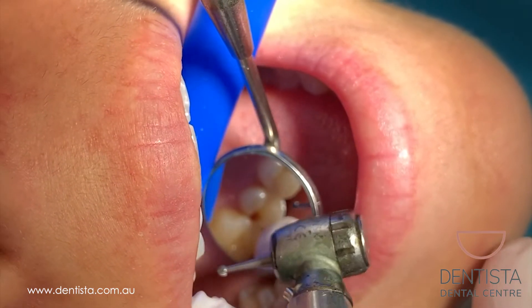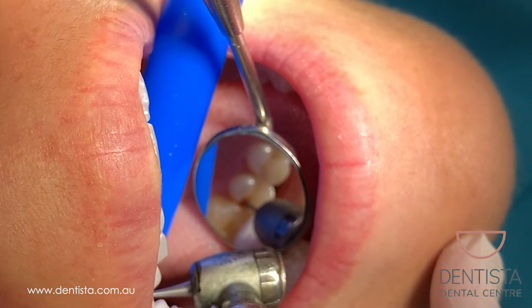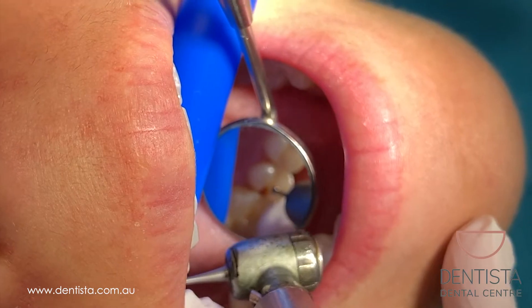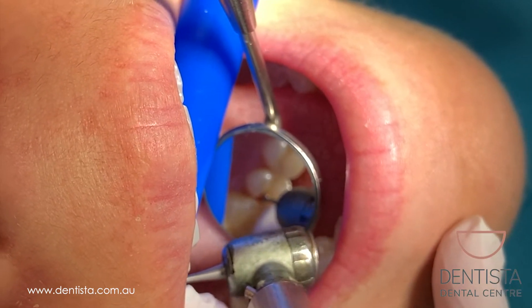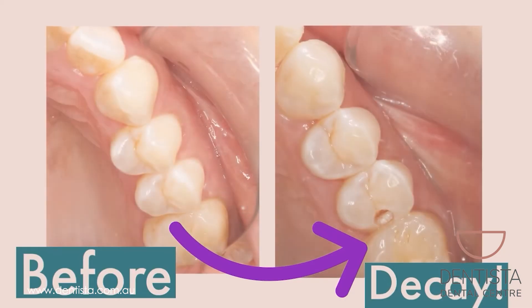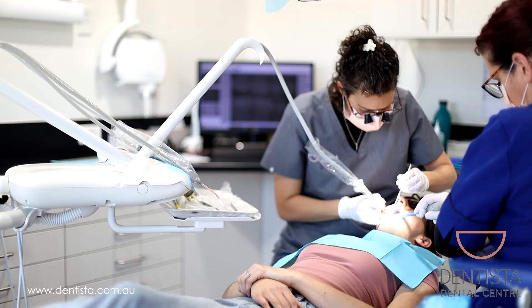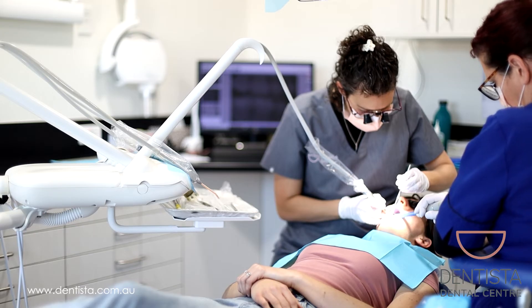Decay is a softening of the tooth. To fix the tooth we need to remove the soft bits using different shaped drill bits until we get back to nice, firm, healthy tooth structure. You can see in the photo on the right the brown decay. Now we just get out the last bits of decay.